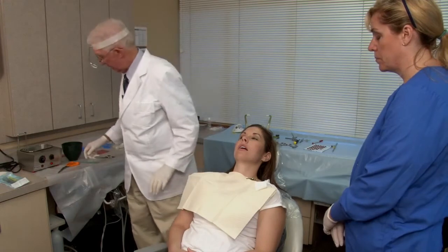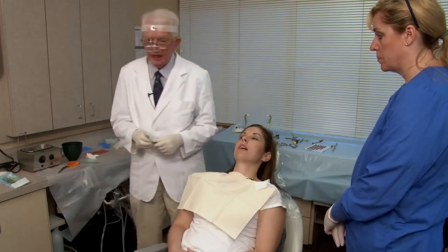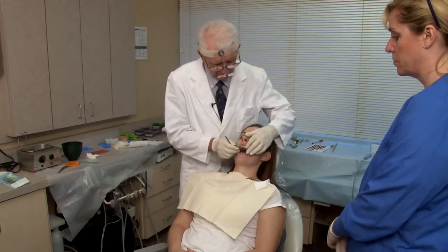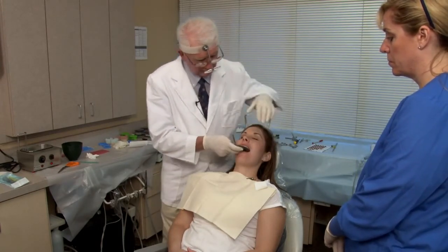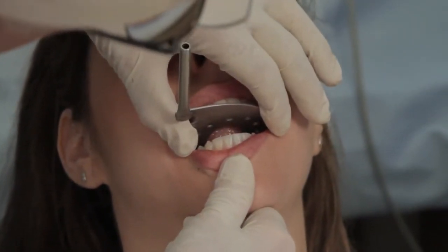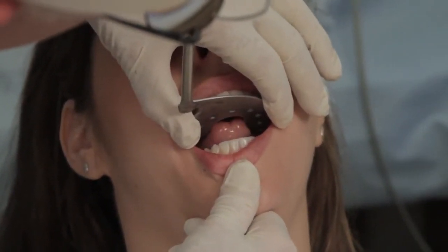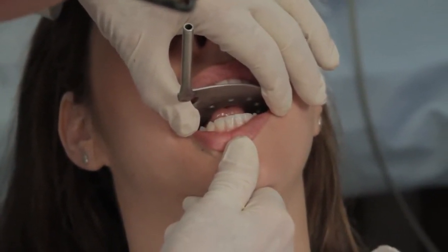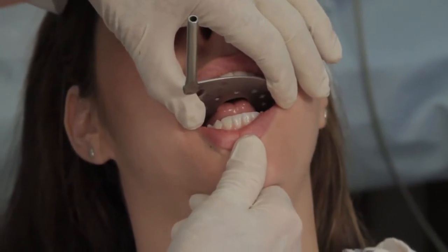But first I have to check and see where and how much Beauty Pink Extra Hard Wax to place. So I'll have the patient put my bite fork in, and I have the patient close, stop. Okay, now open, close, stop. Now close and touch the bite fork. Okay, now you see where it is, open, close, stop.